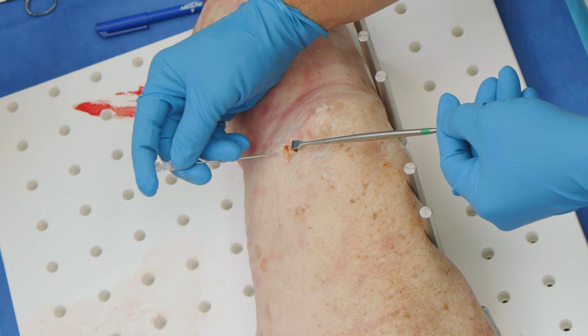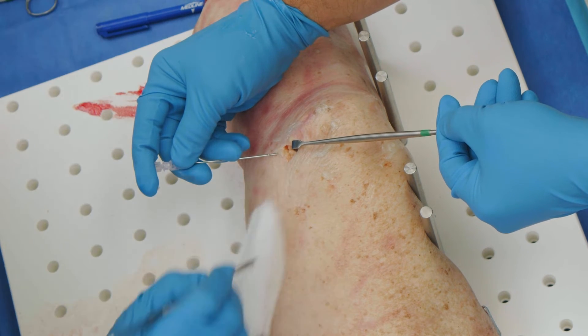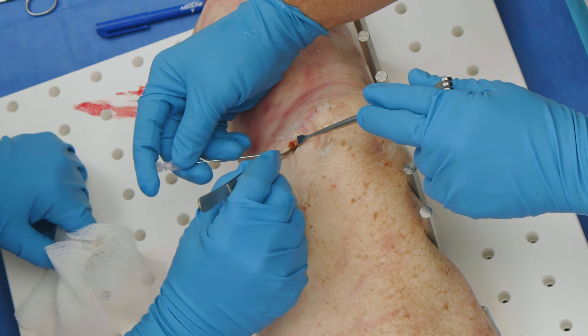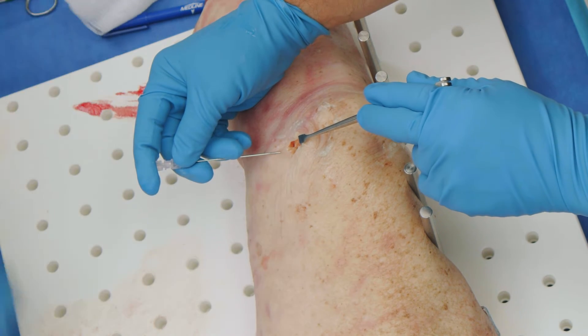I'm going to clean off the superficial aspect just a little bit to get some soft tissue off and get a better visualization. Now I can see it really nicely — and there it is right there. Now we're ready to go and put our anchor in.